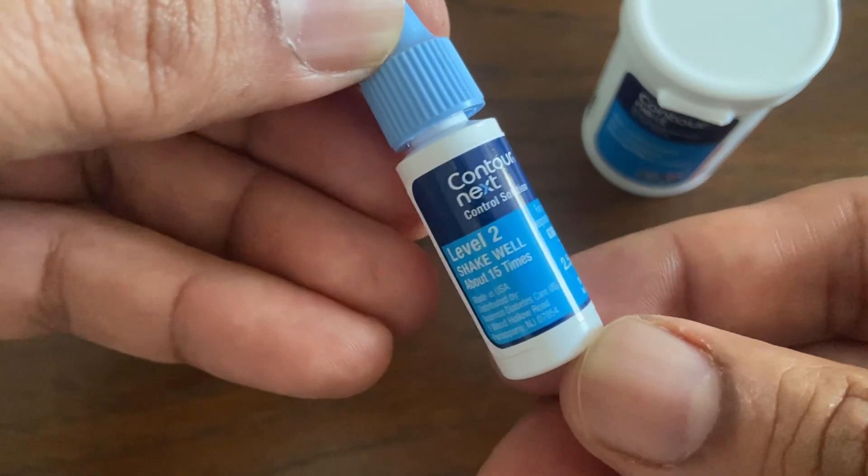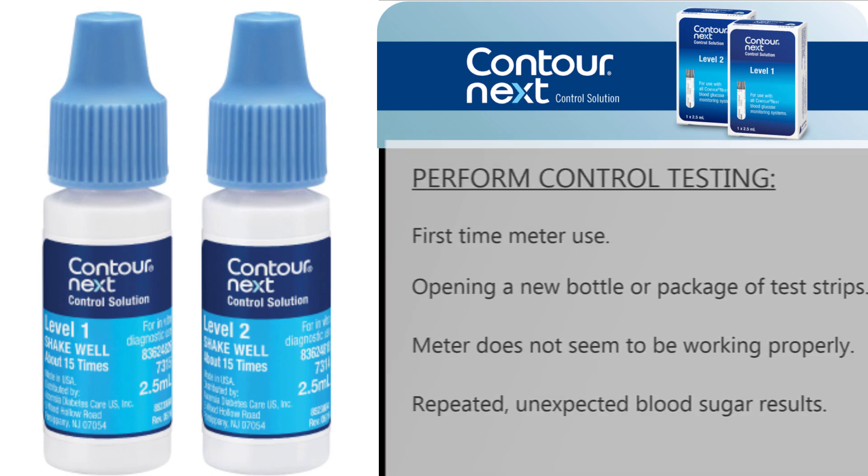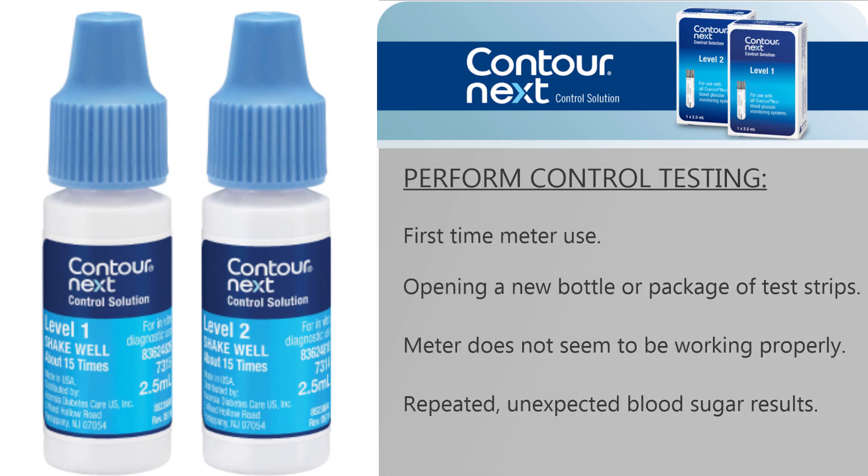This video shows the steps to use the control solution with the Contournext 1 blood glucose meter. Perform a control test when using the meter the first time, when opening a new bottle of test strips, or if the meter does not seem to be working properly.